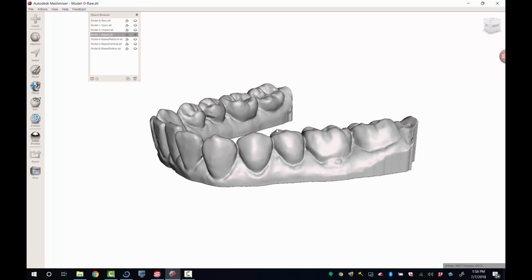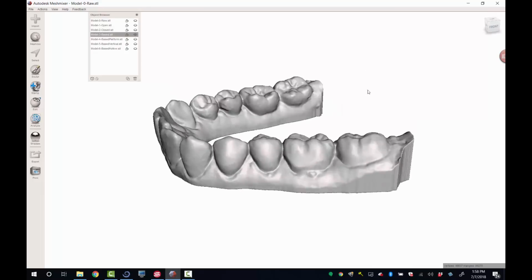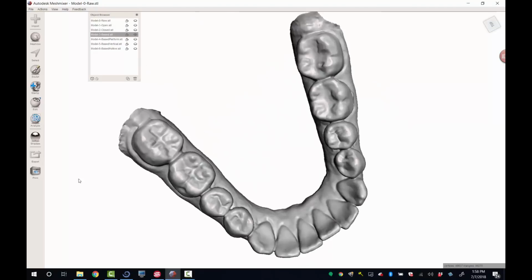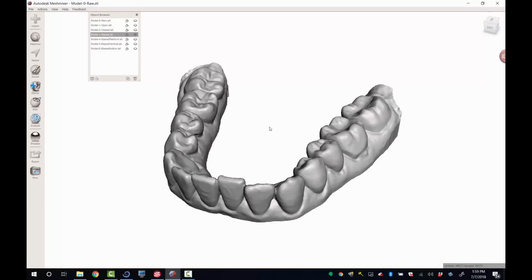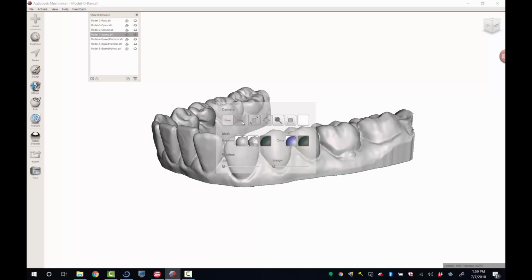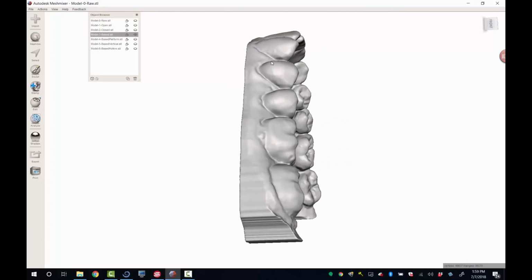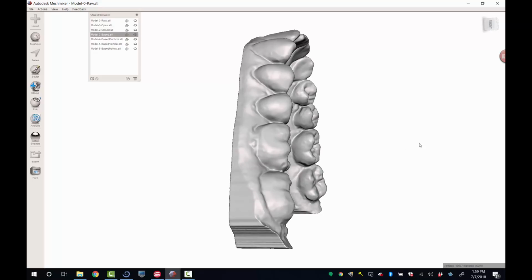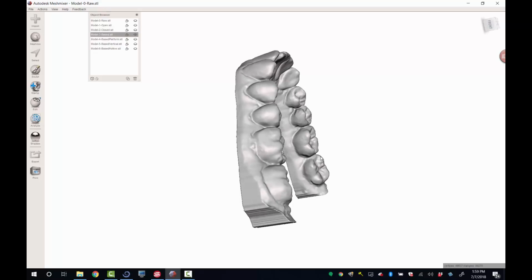Okay? Now, if you want to print upright, vertical, on its heels, by the way, I can't move this in all dimensions. It's limiting me where I can turn. If you're doing that, or you want to have more freedom of moving the model, press your space bar, click on this free. It allows you to move things freely however you want. So if I want to print this model like this, sort of upright, I can fit a lot more models on my print bed. Now I'm going to show you that in a minute in the actual print software, so just bear with me for a moment.